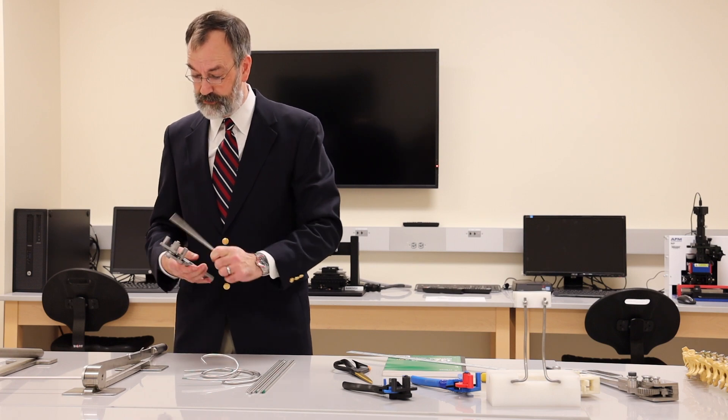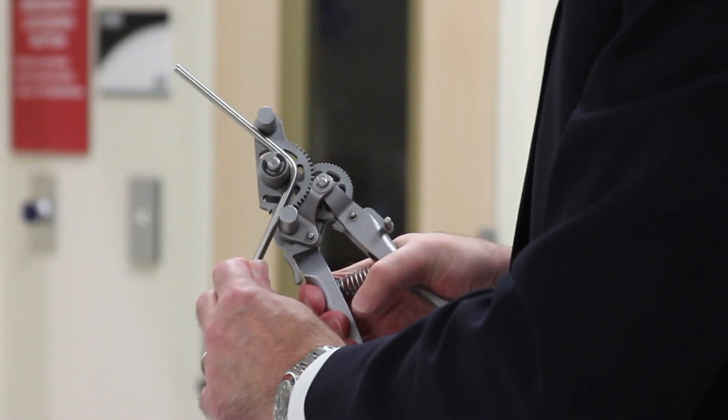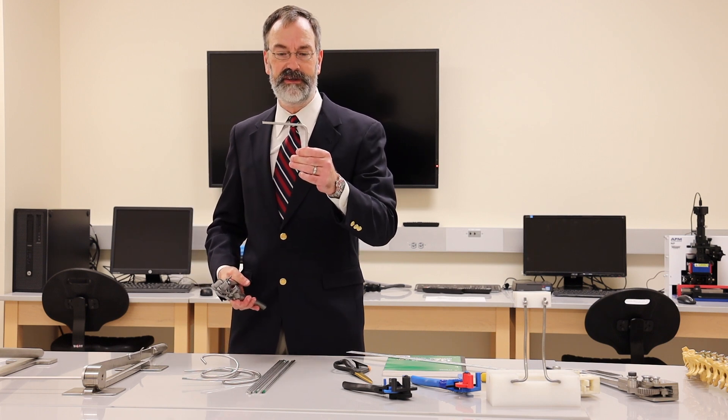We can demonstrate the rod bender's capability of doing the 90-degree bend straight away on this quarter inch rod. The biggest surprise most people have is how smooth it is and how easy it is to operate.